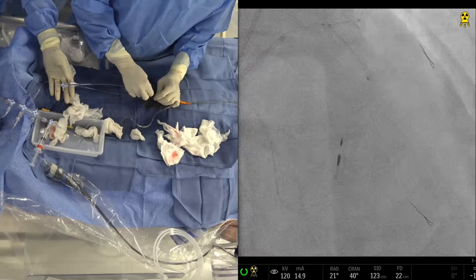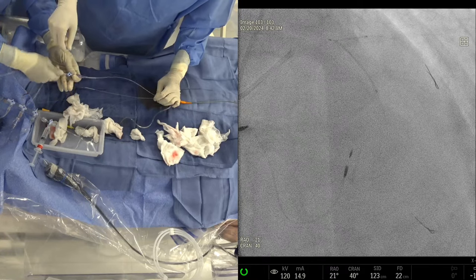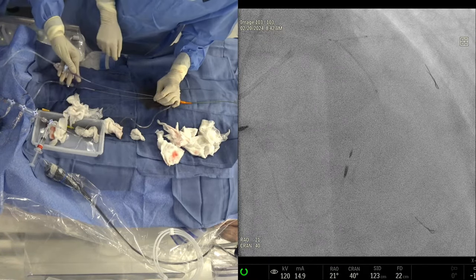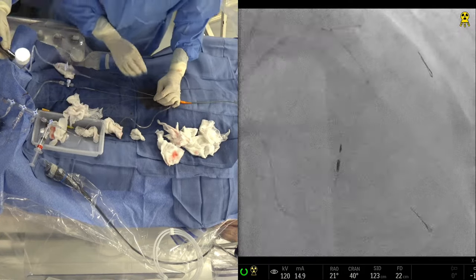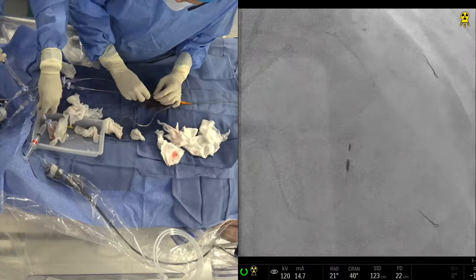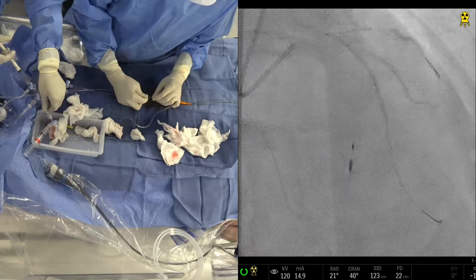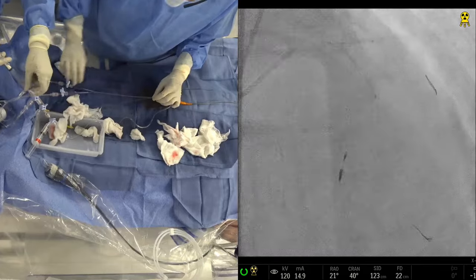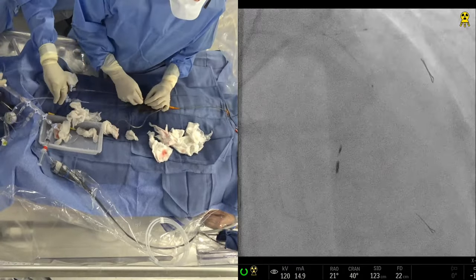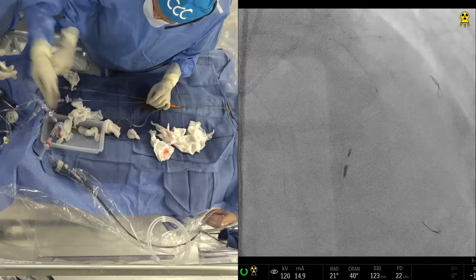Okay, good, connected, quite easily. Because of the longer length of the stent? No, the LAD needed to be longer. Remember, I had to cover, because the first LAD stent was the shorter one. So we needed full coverage. That was the whole point. I think the entire case was there. And then they will show the IVUS in the end to show the optimization.